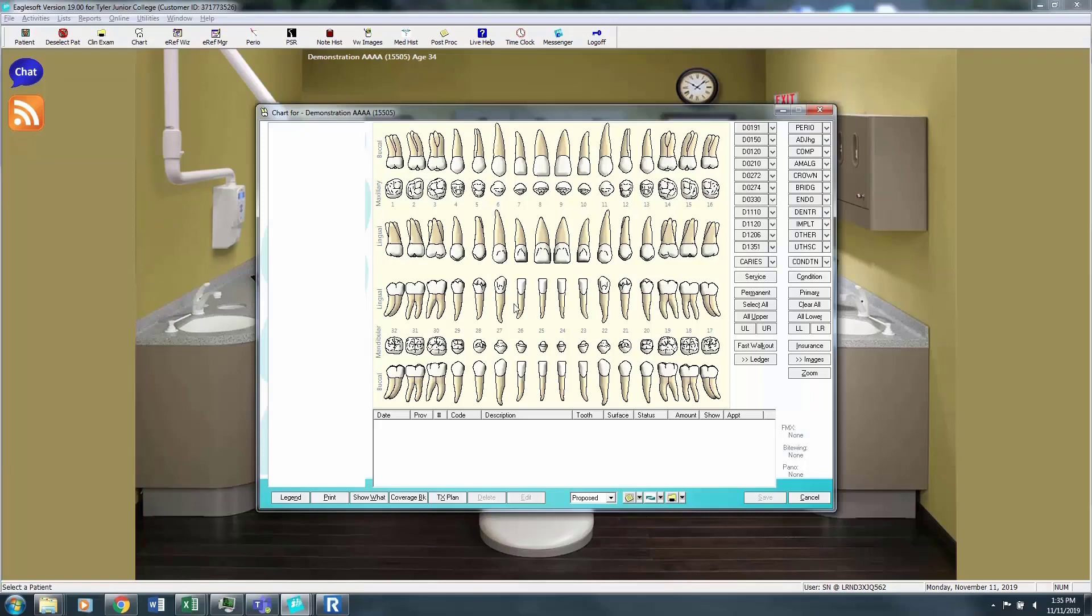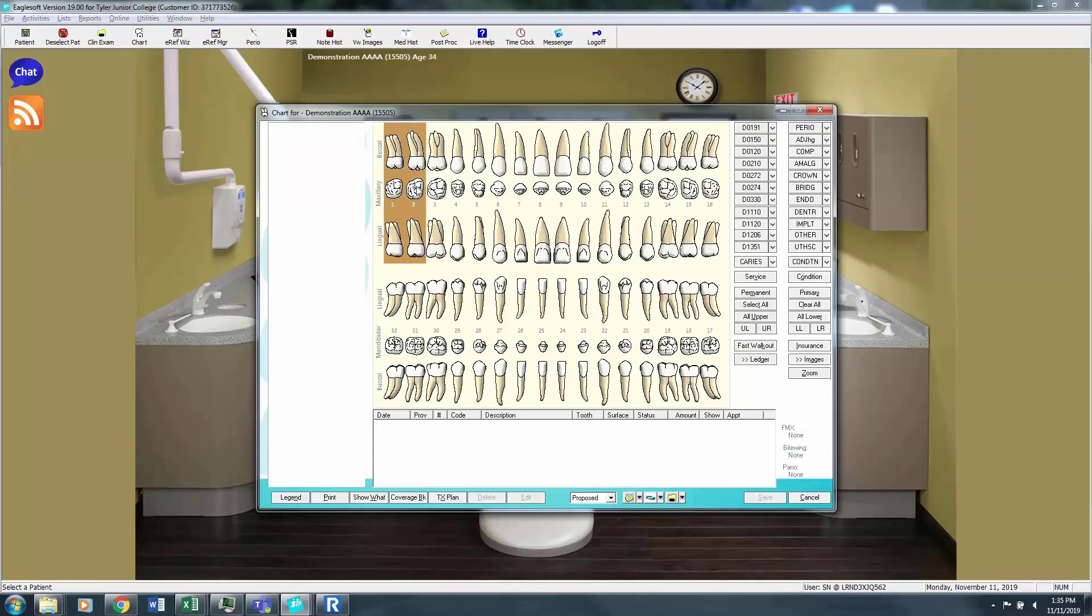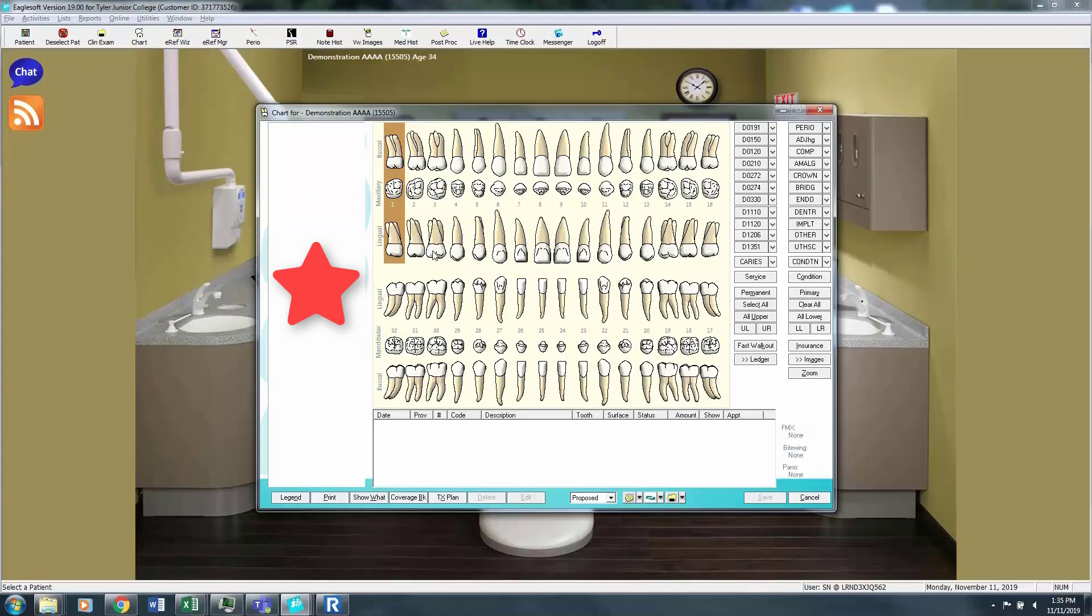Prior to dental charting I would have completed the patient's radiographs and hopefully taken the intraoral camera photos as well. As those images are taken they will be assigned a number and then when I come to my dental chart, when I click on the tooth that I'm charting, the images will populate on the left side. So for this patient I don't have any radiographs, this is just a demonstration file.